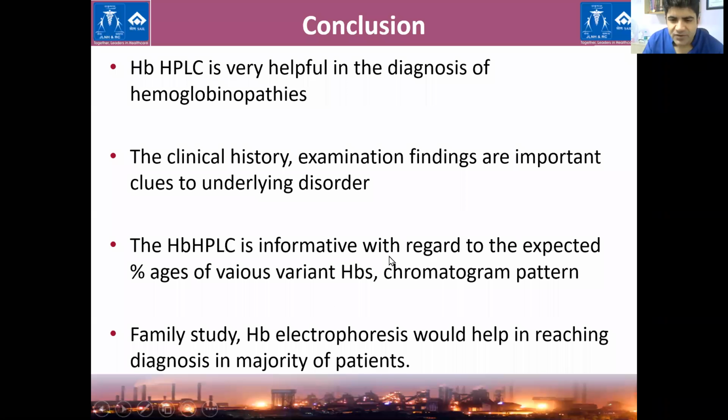While we are waiting for some questions, I got some questions which were sent to me, if you could take them in the meantime. Yeah, sure. We all know that HPLC is the gold standard these days, but you also highlighted very nicely the role of electrophoresis in some of these cases.